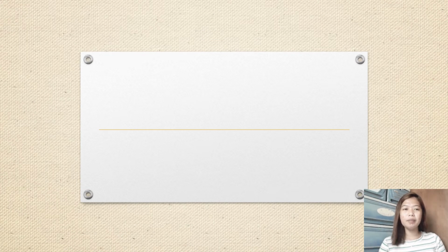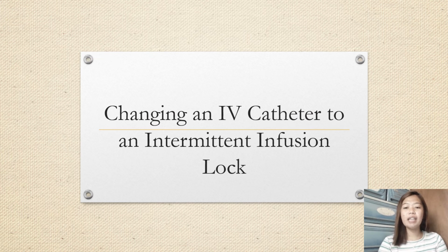Good day, everyone. I am Daniela Soneja, and for today, I will be discussing changing an IV catheter to an intermittent infusion lock.